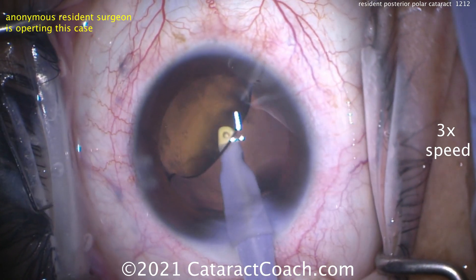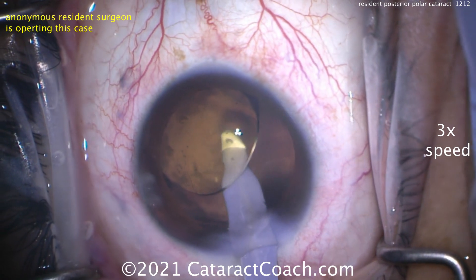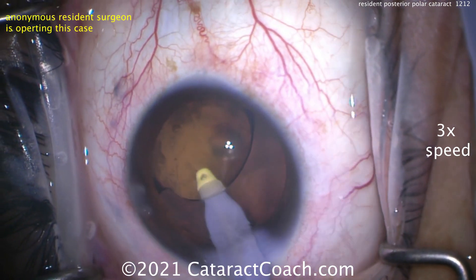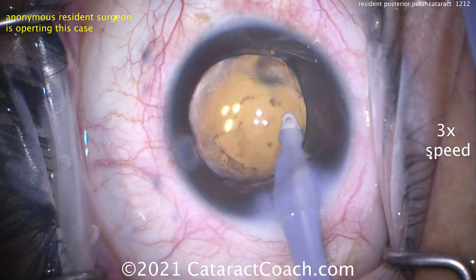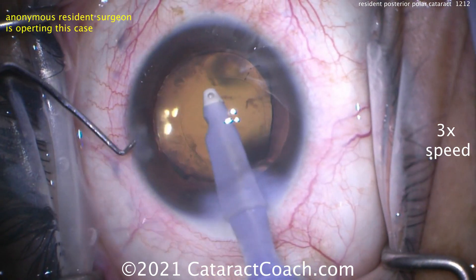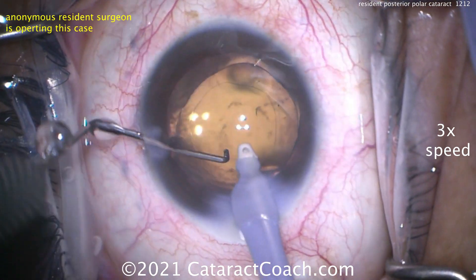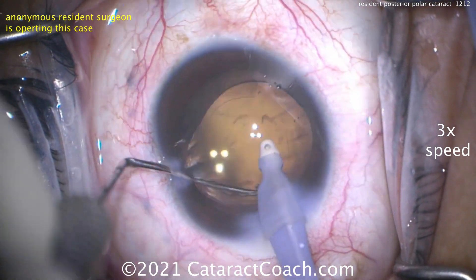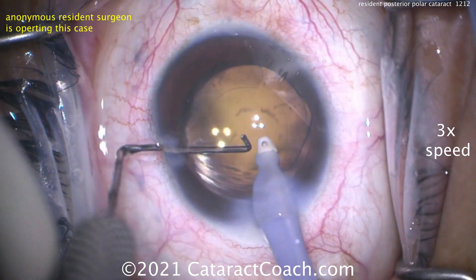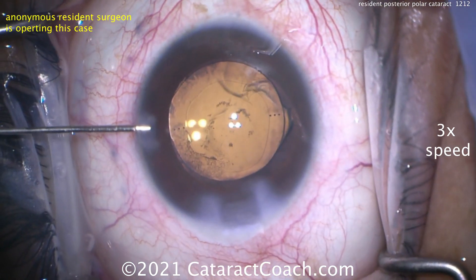Remember, it's a toric lens — you have to remove the viscoelastic from behind the optic. I help the resident by lifting that optic and going underneath it, so the viscoelastic can be removed very nicely. Get the lens back into position. Now we can do a fine tuning of the lens position, being very careful just to rotate and not push posteriorly. Once we have that lined up with the marks on the cornea — that looks pretty darn close right there.